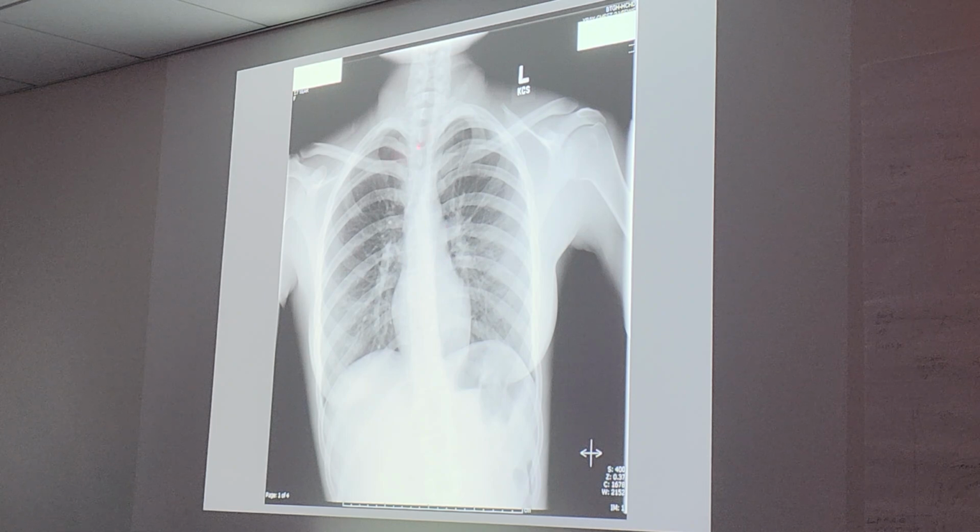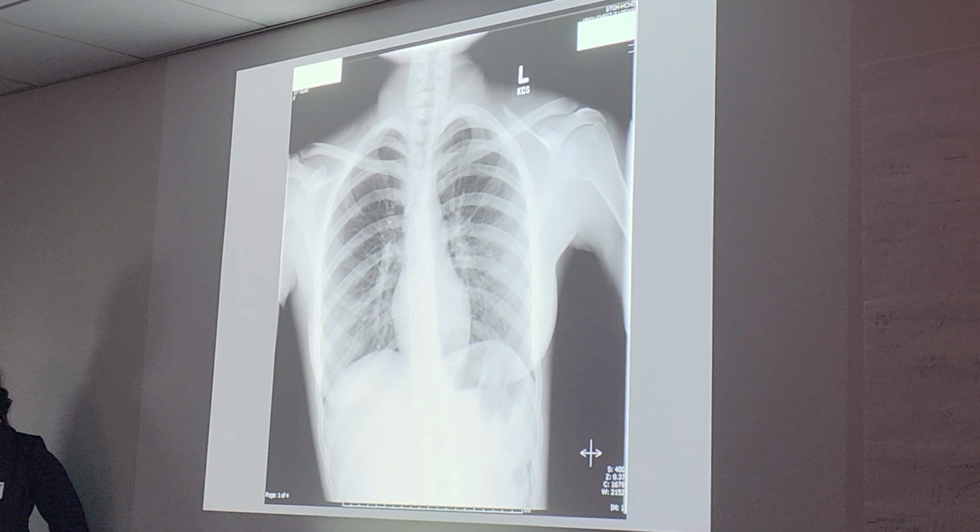Let's see here, centering. So when you say collimation open, what are you looking at now? Centering is pretty close, on the top, to T7. Collimation, take a look at the chin here. It's not how we want it on the sides and the top, both of them. Almost clipping the right foot. Clipping the right way, because we got everything we need for a chest. We aren't going over it.